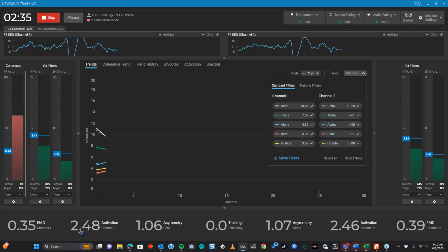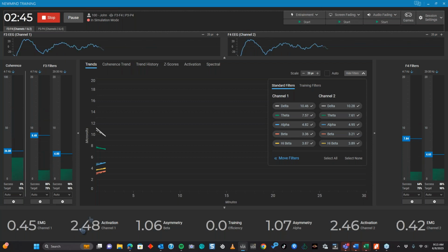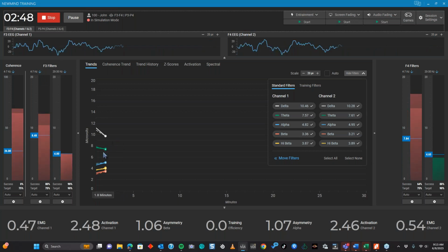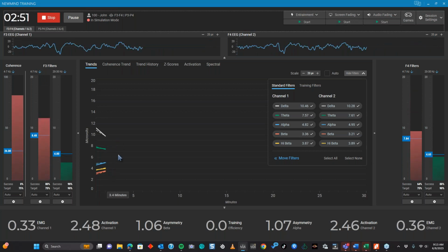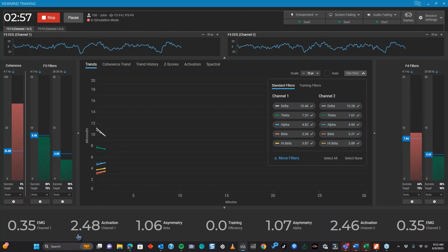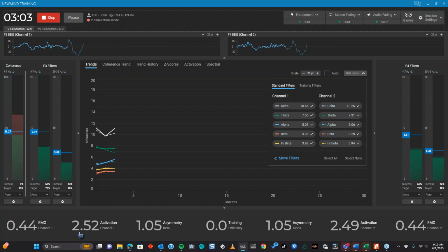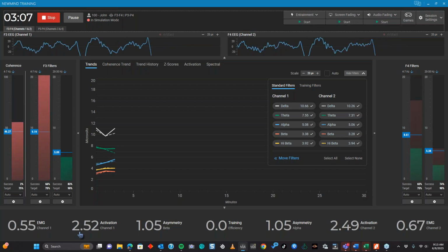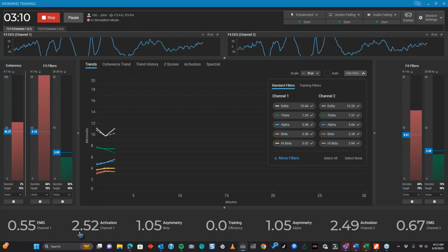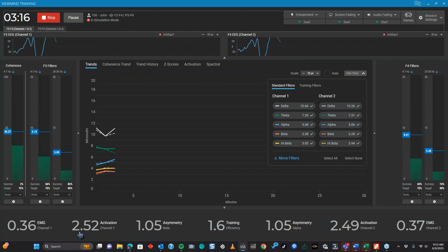Now on the opposite side, if we get numbers below 2, then that's a brain in a state of over-arousal. You might have a fairly normal range of delta and theta, but the beta is running higher than average. So the amount of space we would see in the trend graph between delta and theta and beta is going to be pretty narrow. In a lot of cases, if we're dropping below 2, and definitely if you're down in the 1 range, that could just be from artifact.